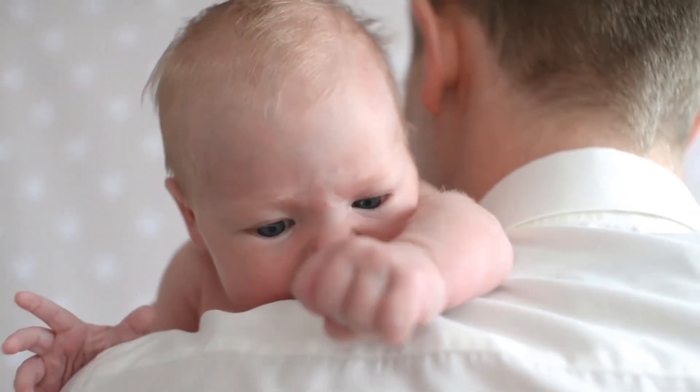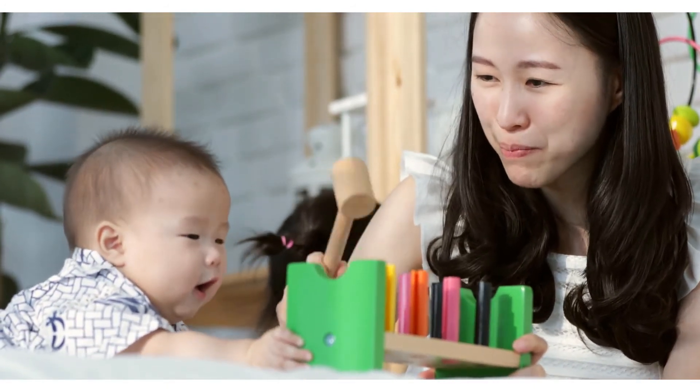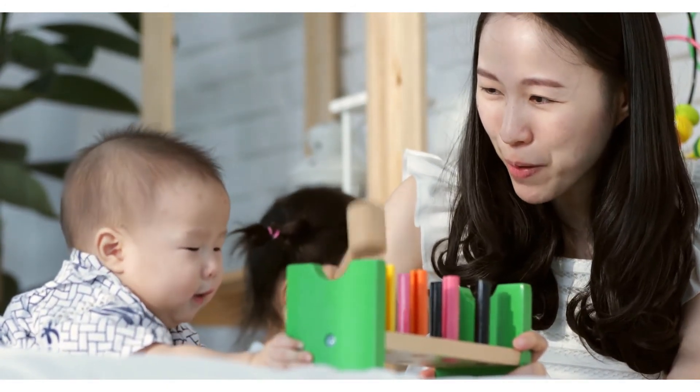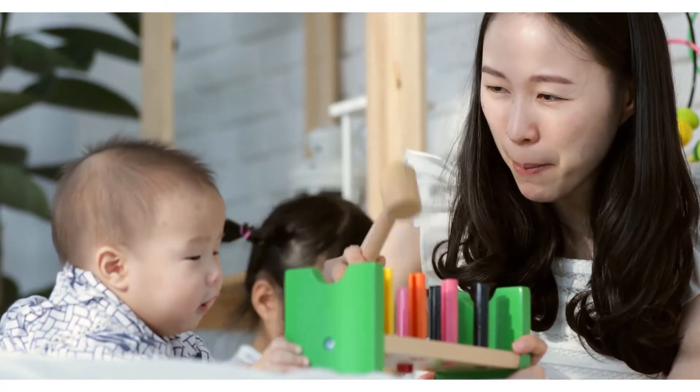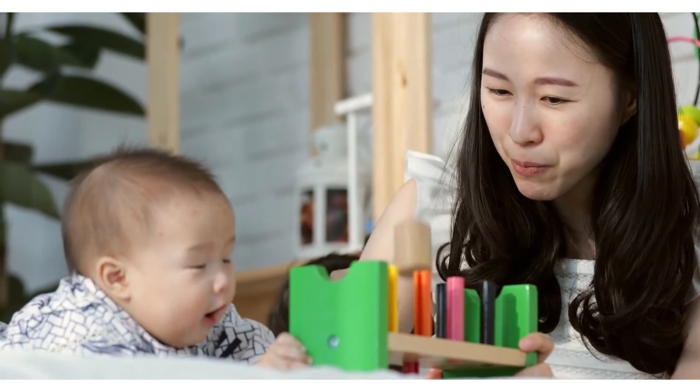Notice: keep the syringe away from heat. Do not wash the syringe with corrosive chemicals. Please allow 1–3 cm error due to manual measurement and make sure you do not mind before ordering. Please understand that colors may exist.